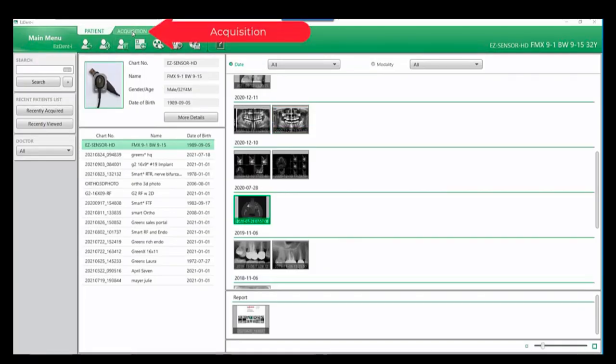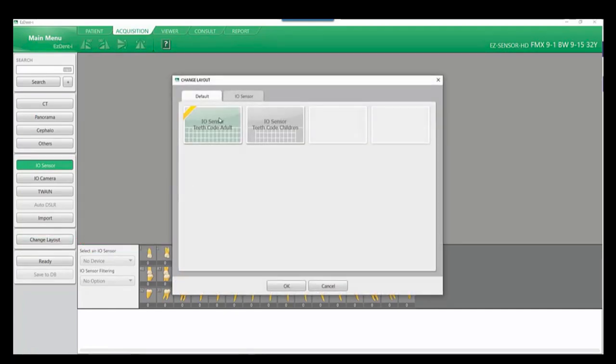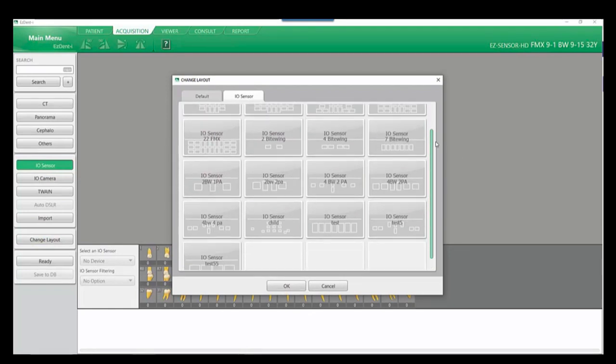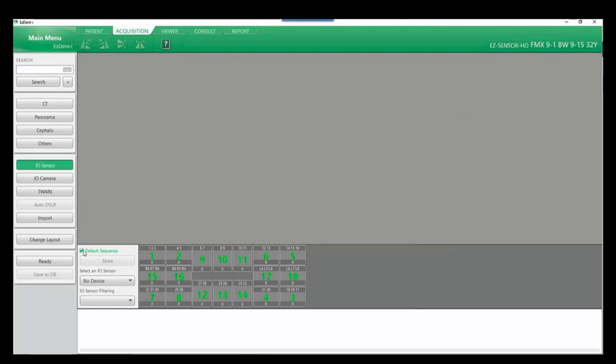Select the acquisition tab at the top of the Denti window. First we will look at the change layout options, where we can choose from either default IO sensor mounts or custom mounts which we have created. You'll see all your mounts throughout this window. Right-click to set the default mount — you'll notice the mount has been changed to our selected 18 FMX.